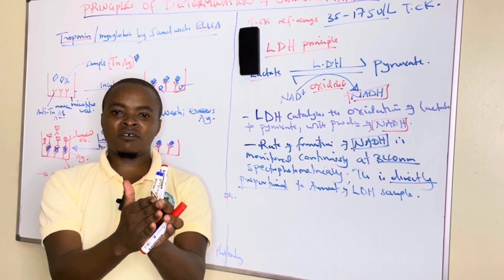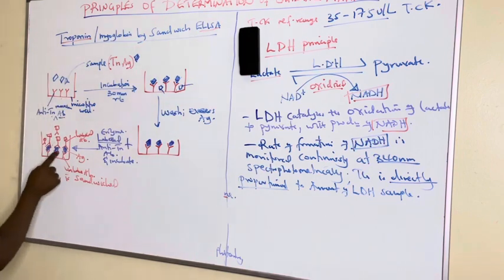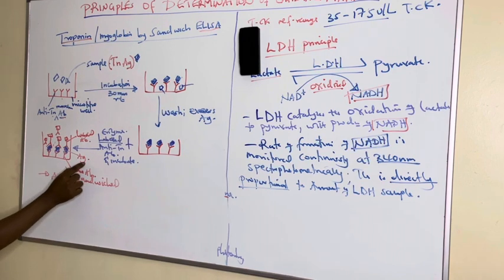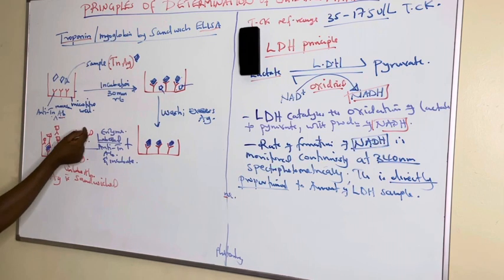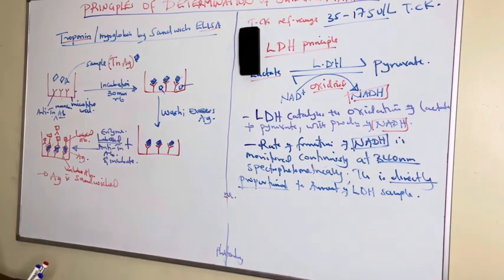And this is what we are calling sandwich ELISA. So we see the two chapatis sandwiching the egg, the troponin antigen: the unlabeled anti-troponin, then the labeled troponin antibody, sandwiching the antigen from the patient sample in between.